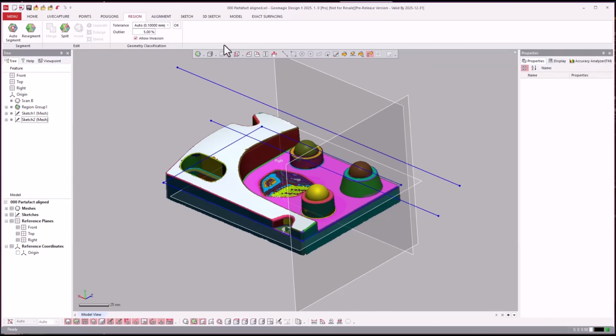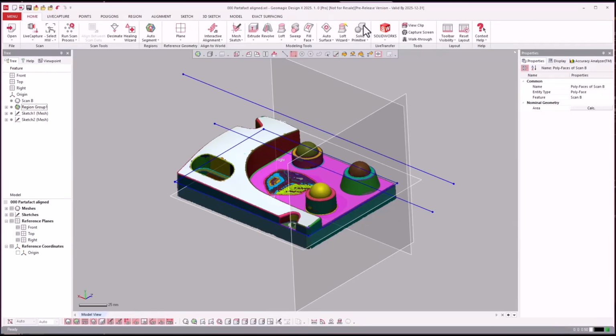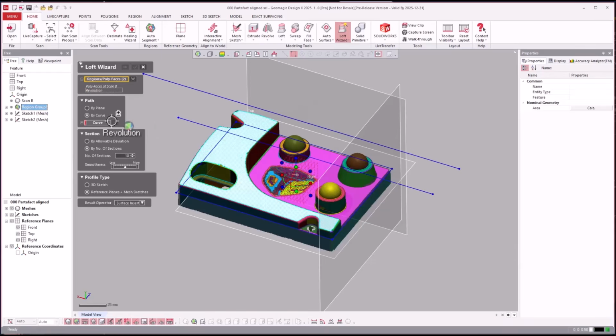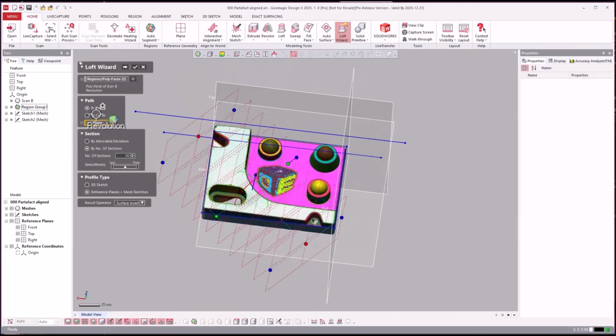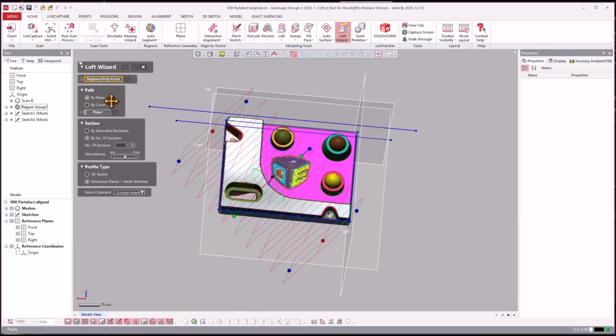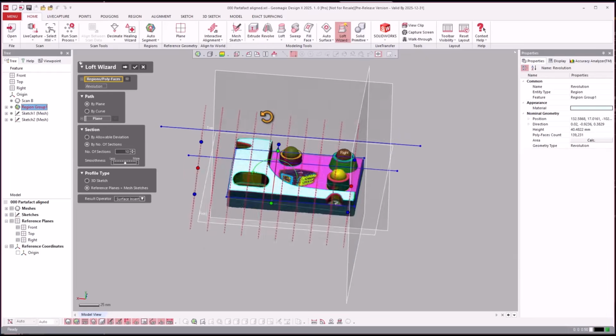I just created another region. Oh, goody. So now I will click on that. Let's just say we want to do a loft wizard to it. And this happens with DesignX, by the way. I did by curve last time, and you're like, hey, what's going on? You have to remember to toggle back over to plane. Otherwise, you'll look at it and you get some very interesting results there. That's all.